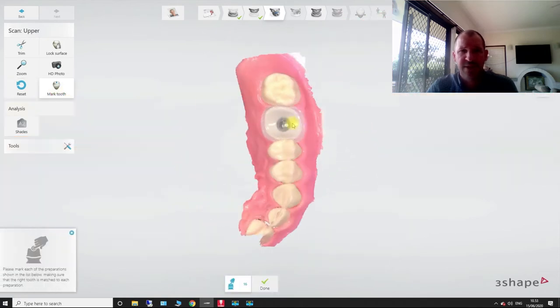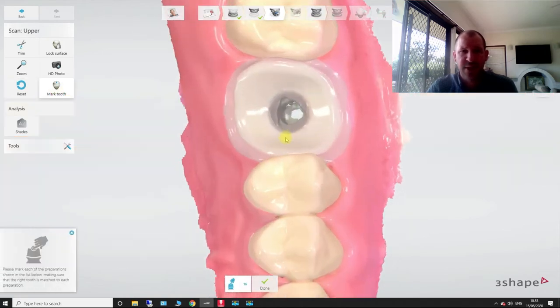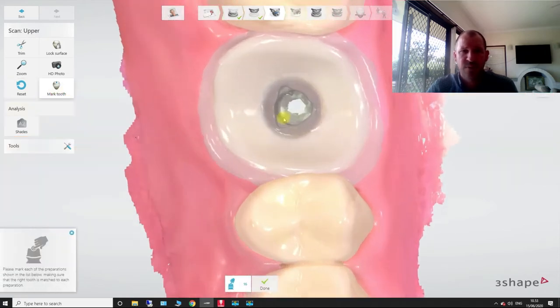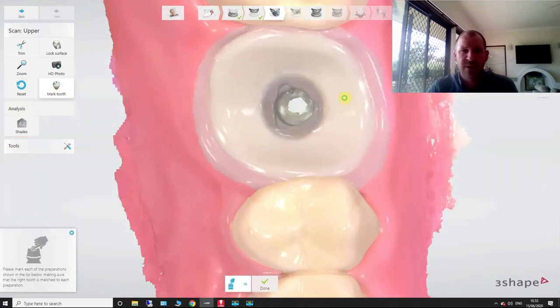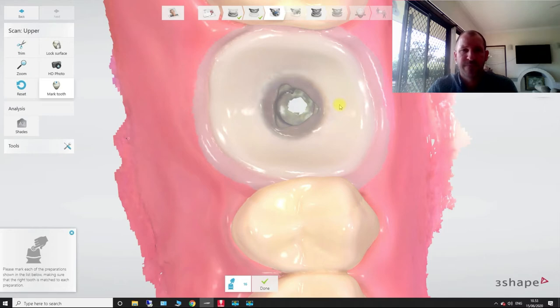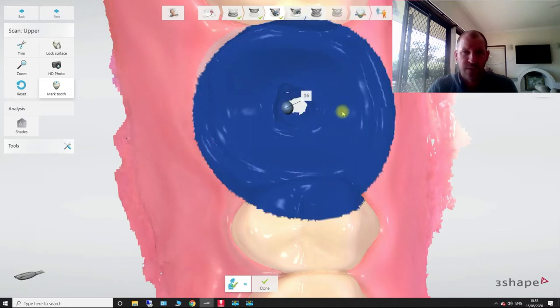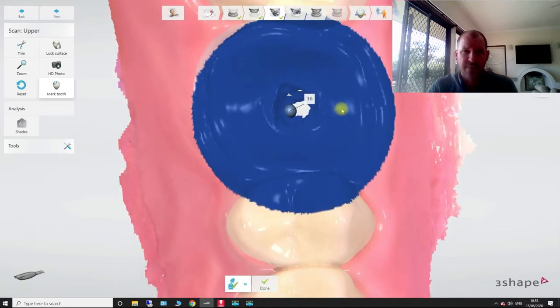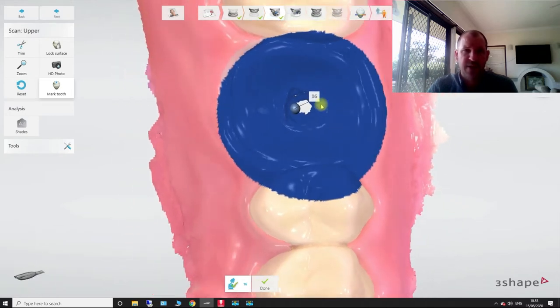So after this is done, it's going to ask us to mark the tooth again. We're going to click in the middle. Now, after that's done, I'll just move that about there. Now, you can alter this cutout diameter here.